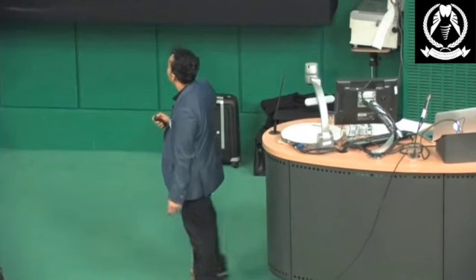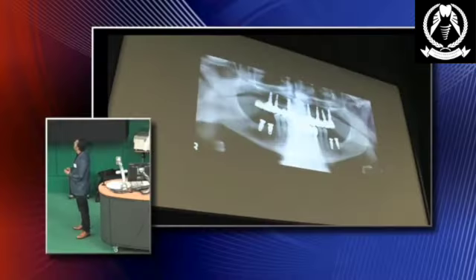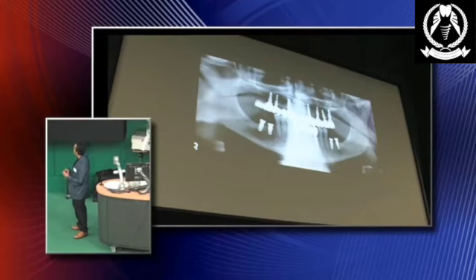And he just doesn't like dentists, because all they did over the years is every time he had a problem, they used to remove his teeth, to the point he had very few teeth left. So eventually we went through the whole protocol, we talked to Mr. K, and we did something like this for him. Now in the upper arch, because he had no teeth, we put 7 implants in. We gave him 14 teeth that he functions with. They're not the prettiest things in the world. In the lower, we kept some of the good teeth. So we do sometimes keep teeth.